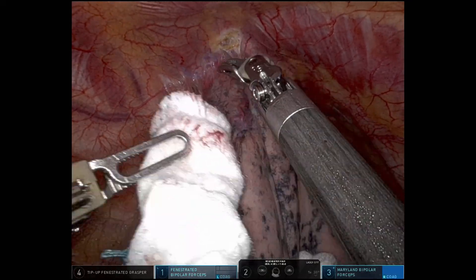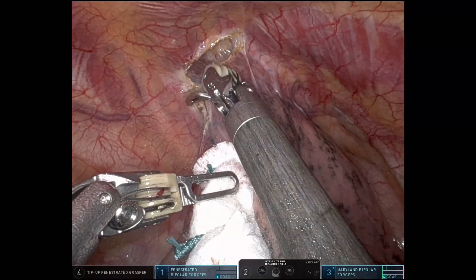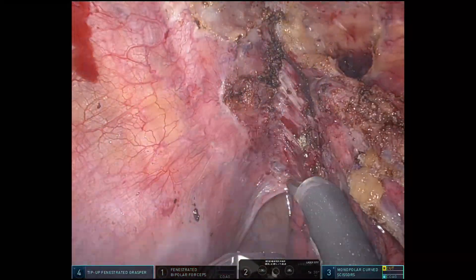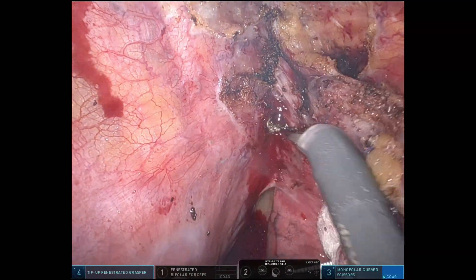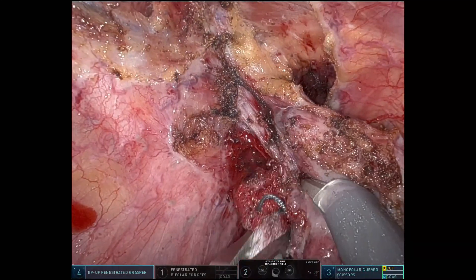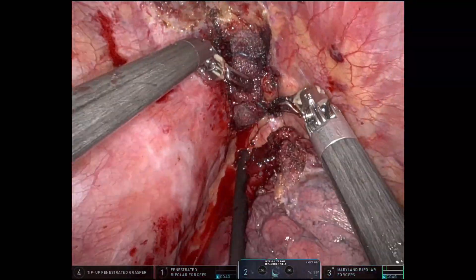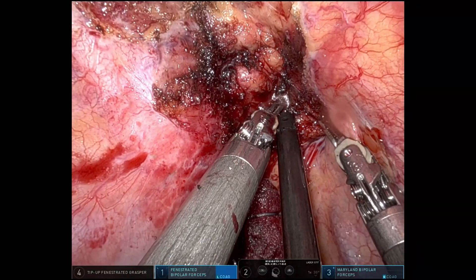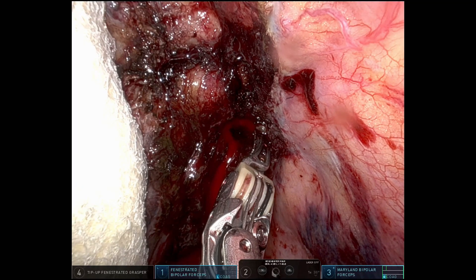In this case, we are initially releasing adhesions of the upper lobe to the apex of the thoracic cavity. This is a right upper lobectomy due to pulmonary aspergillosis. During the section with the monopolar scissors, a small artery in the apical region was injured and continued bleeding despite our attempts at hemostasis. Bipolar coagulation was attempted without success, and we identified a small artery that appeared to be an aberrant branch of the subclavian artery directly supplying the diseased lung area.